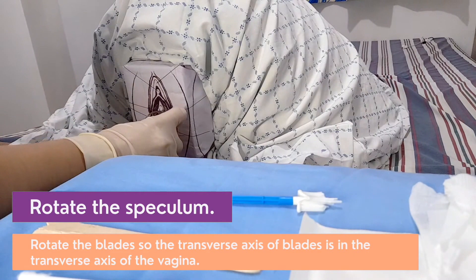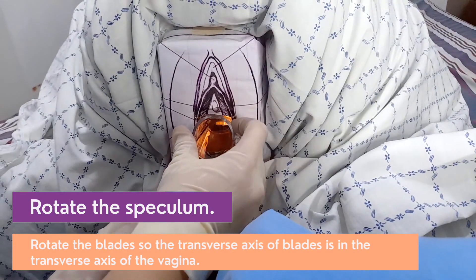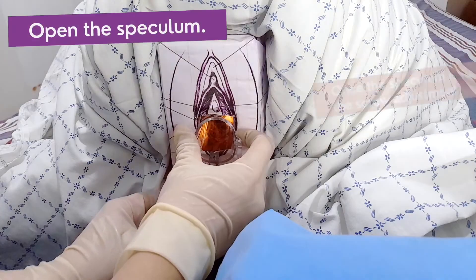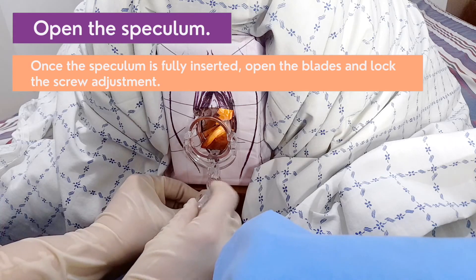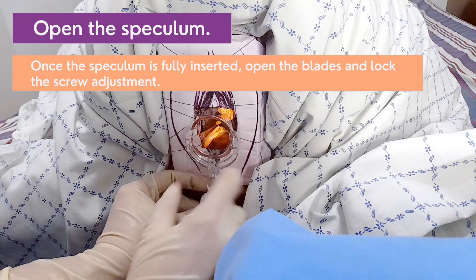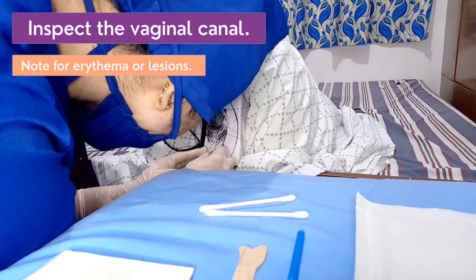Rotate the speculum so that the transverse axis of the blades aligns with the transverse axis of the vagina. Open the speculum. Once the speculum is fully inserted, open the blades and lock the screw adjustment. Inspect the vaginal canal and note for evidence of erythema or lesions.